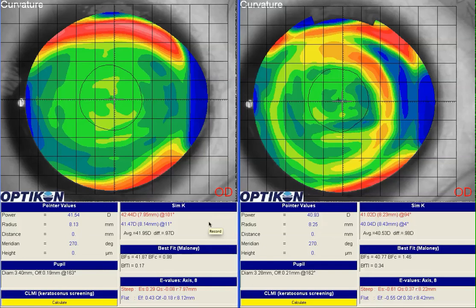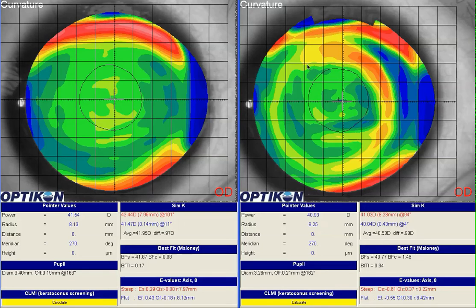This is an orthokeratology case where the patient has recently switched to semi-scleral lenses, and after two lens designs we're still getting undertreatment. The posterior topography shows a not very well delineated reverse curve or treatment zone underneath the lens, and the patient is also undercorrected. With this kind of appearance, I'm guessing that the lens is vaulting a little bit too much and not getting the fluid forces we need to produce the refractive results we're after.